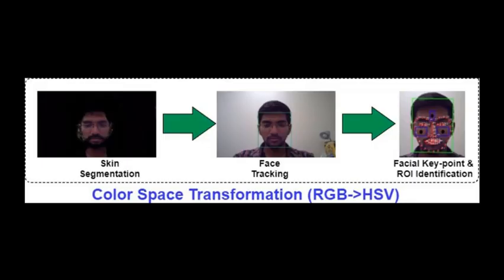Step 1. Frame capture and color space transformation. A change in color space from red, blue, and green to hue, saturation, and value from literature and experimentation shows the extracted signal to contain less noise with dominant heart rate information. Then, to avoid misinterpretation of face and failure of face detection, we employ an automatic skin segmentation step in our algorithm. It first detects the face, then creates a model histogram of the detected face, which would then be used by back projection to consistently locate the skin region.